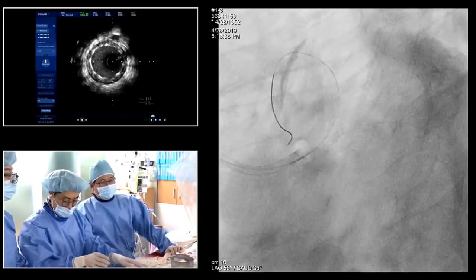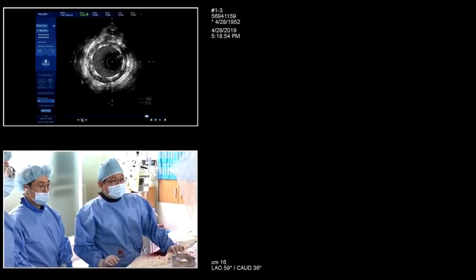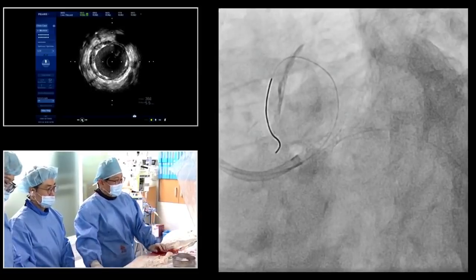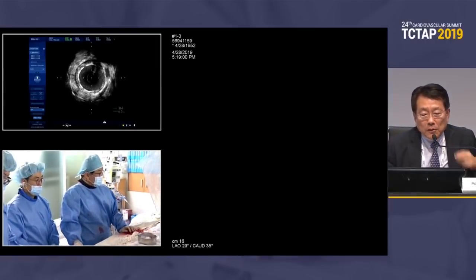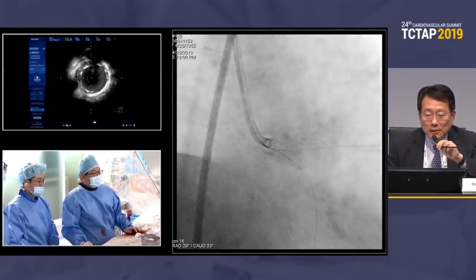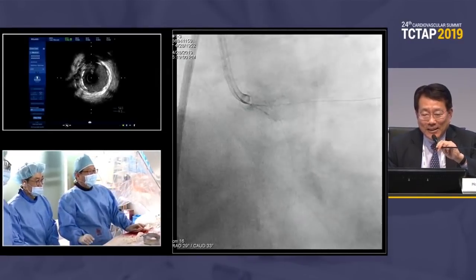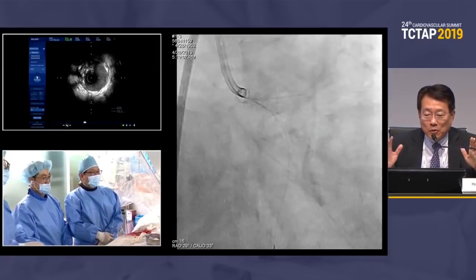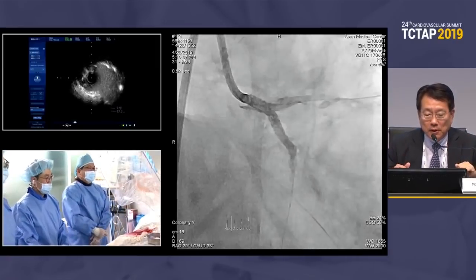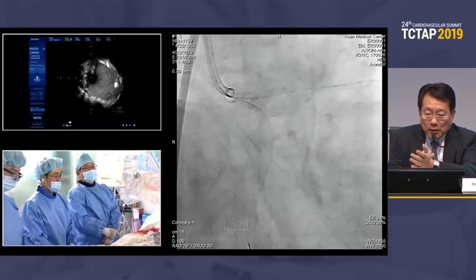But I think it's quite good, right? Not much problem. So great, that's good. Afterward, you may need another long stent for the LAD section later. Anyway, the main intervention is really perfect, not bad. Thank you.